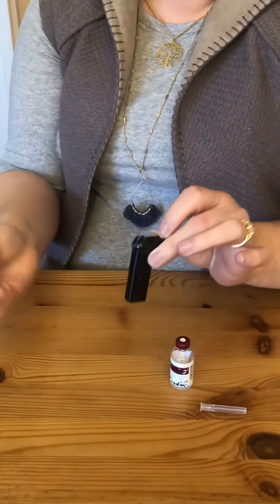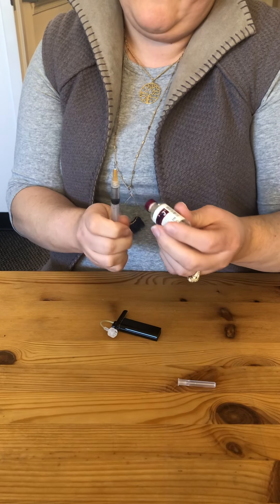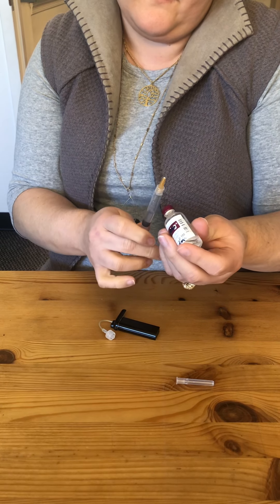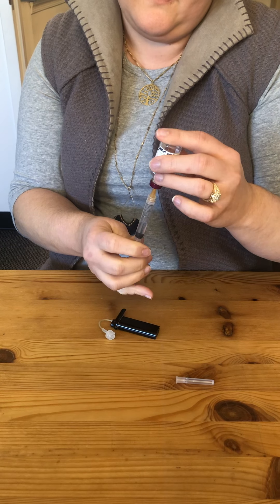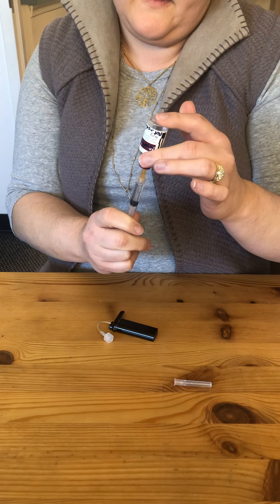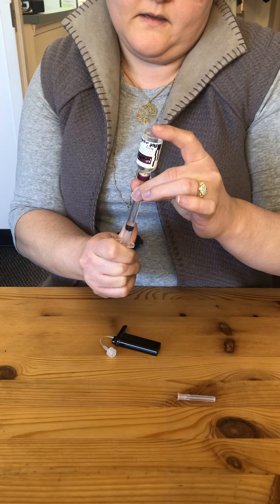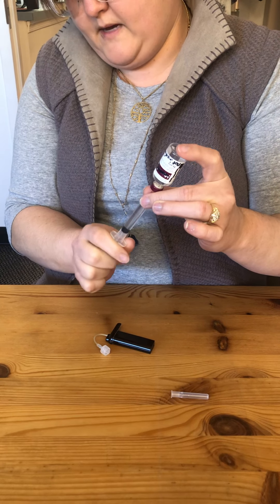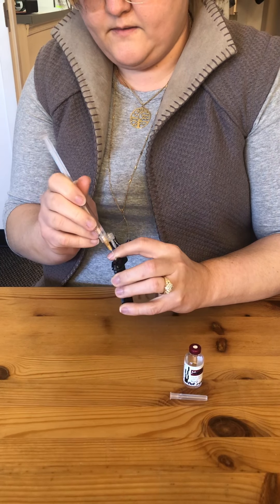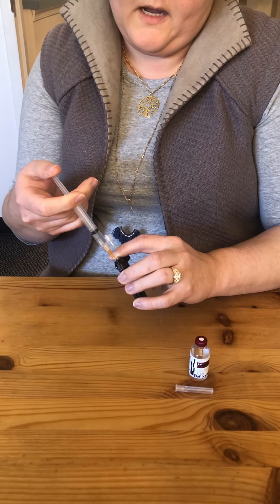Now I've removed the air from my cartridge. I'm then going to flick the air out of this insulin, draw back, and pull up the amount of insulin I'm actually going to use. If I'm going to use 3 ml's or a full 300 units, I'm then going to instill that air into my vial, pull back my nice clean bubble-free insulin back to that max fill line at the 3, and now I can instill that into my cartridge. Now I'm not going to have those air bubbles and I'm not going to have those random high blood sugars.